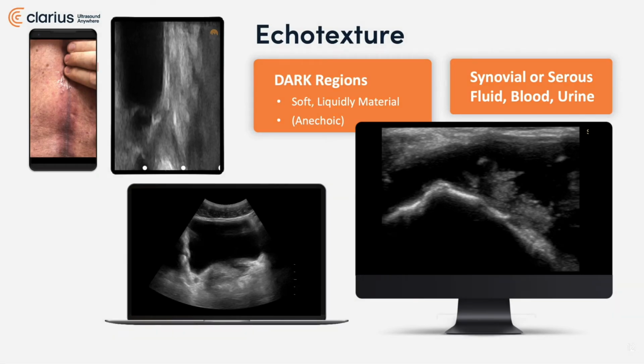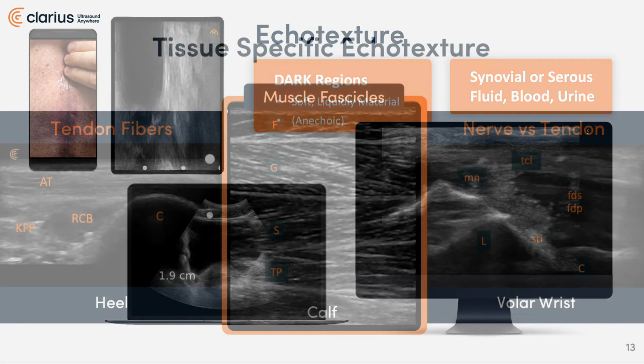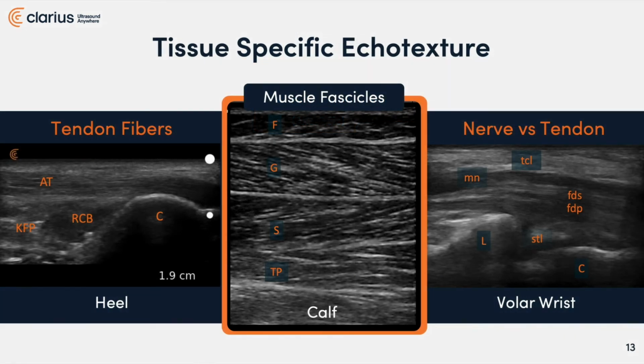So what I want to actually do now is to go to the tissue between the rest of our body, and your fingers will know this because as physical therapists, we've been palpating tissue, well, I guess our entire career. But if you take a look at this bottom left picture, you'll see that here is my calcaneus, here is my Achilles tendon, and that fibrous material you'll see go from my gastroc soleus down and attach to my calcaneus bone. This is the retrocalcaneal bursa.